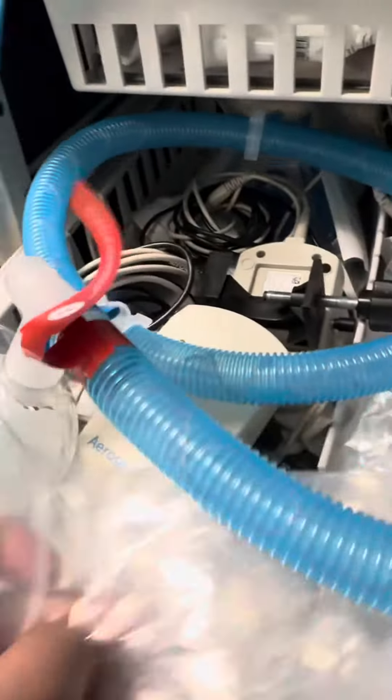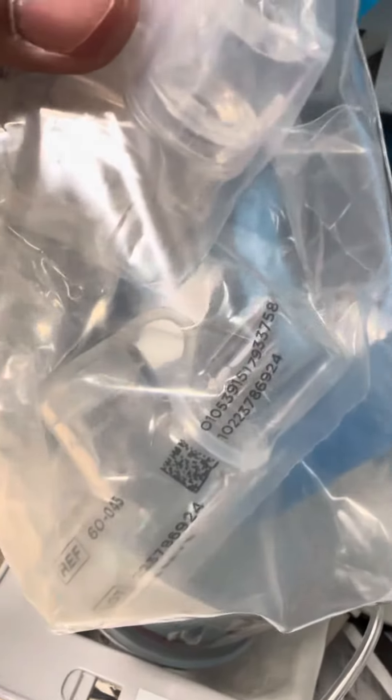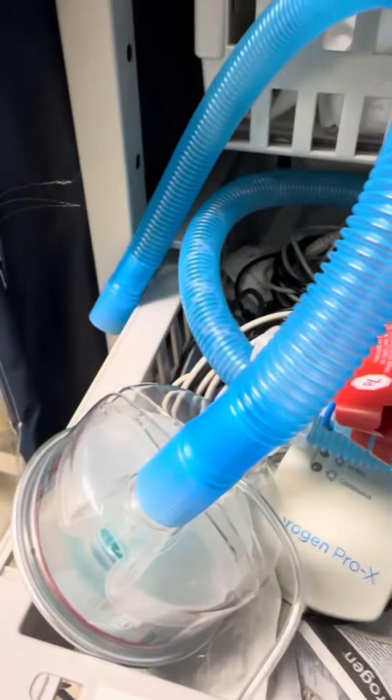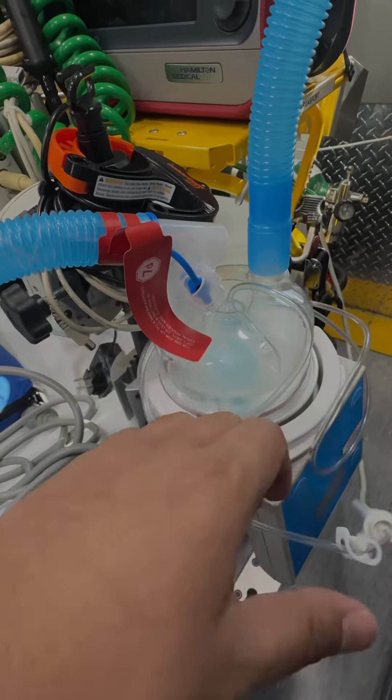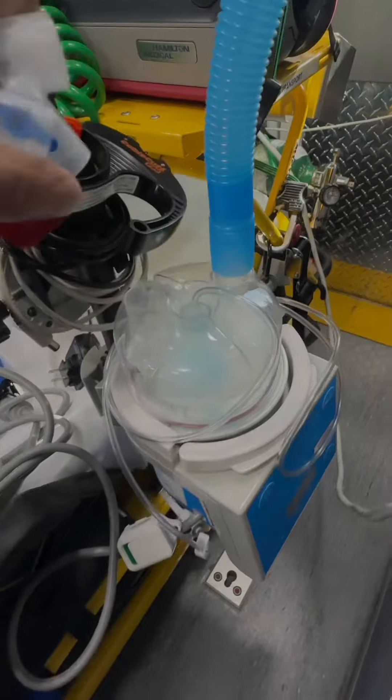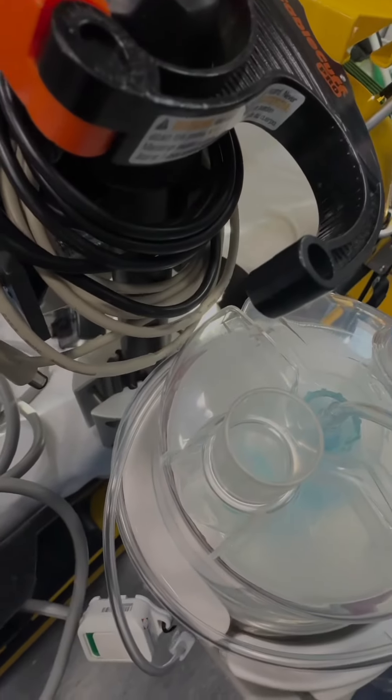If you're needing to do treatments, just use the aerogen cup. Put it right here on the dry side. Much less condensation than our previous system. We don't need to have the water bag. Just clamp it off and just put some sterile water right in there.